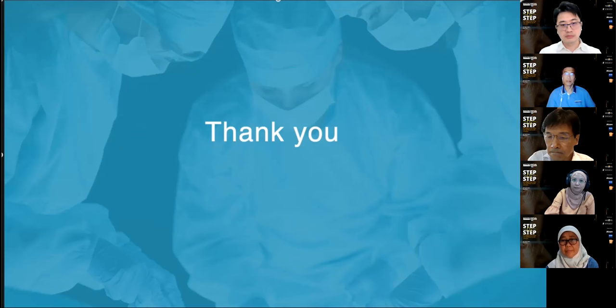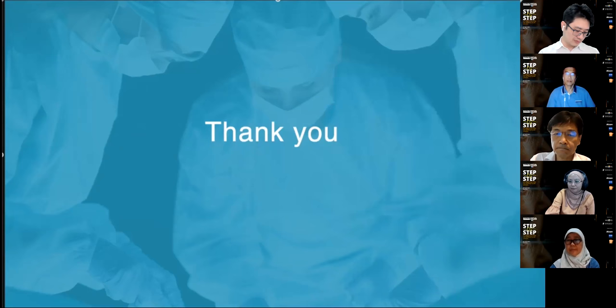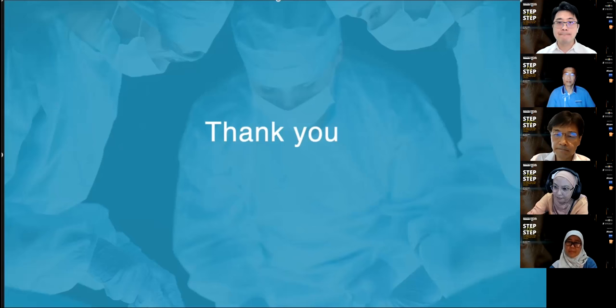Because when I started using the PVDF haptic, hardly any of these incidents happen anymore. Both ends of the haptic can be pushed all the way to the sclerotomy, and the lens is centered most of the time. If it's not centered, it's because my entry point is different, not exactly 180 degrees away, or not exactly 2 millimeters from the limbus, maybe too short or too far. Previously with the PMMA haptic, almost 50% of the time I had to manipulate the length of the haptic to make the optic planar as well as centered. So the problem actually is at the optic-haptic junction.